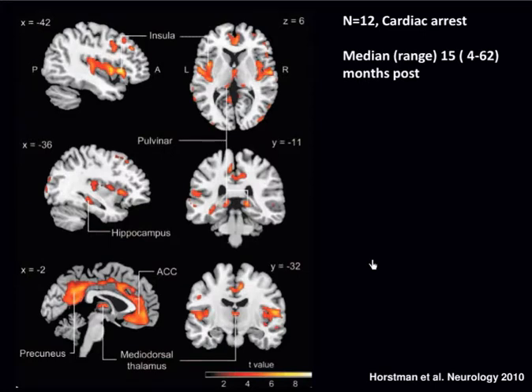This is a very recent study, very interesting, only 12 patients. And what the authors did was they performed MRI, volumetric MRI, in survivors of cardiac arrest. And this was done a median of 15 months after the insult.